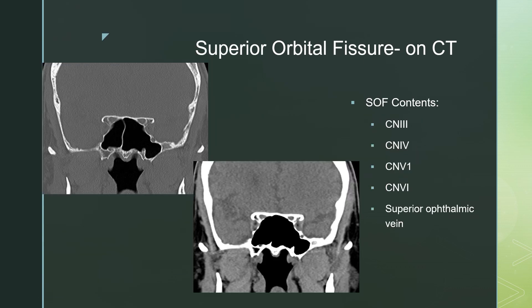The superior orbital fissure transmits cranial nerves 3, 4, V1, and 6, as well as the superior ophthalmic vein. You're looking below the optic canal — it's inferior and slightly lateral. Here it is on the bone windows, and here it is on the soft tissue windows, lateral to the sphenoid sinus.